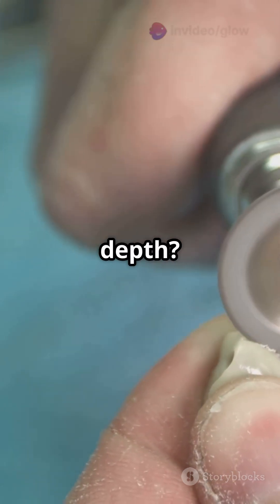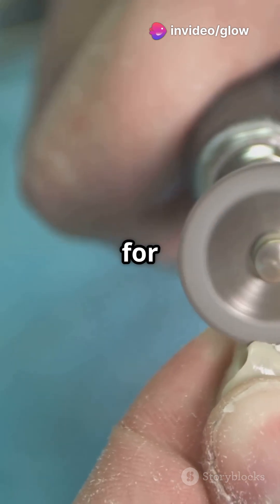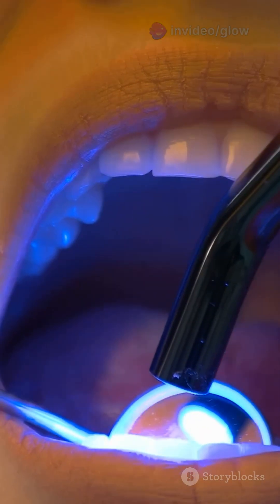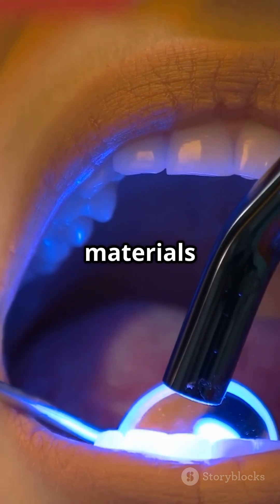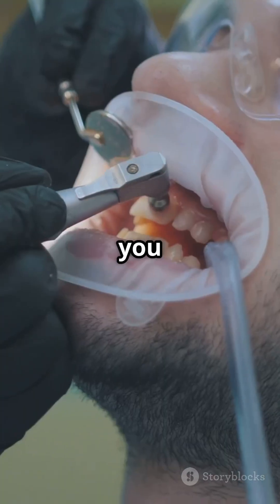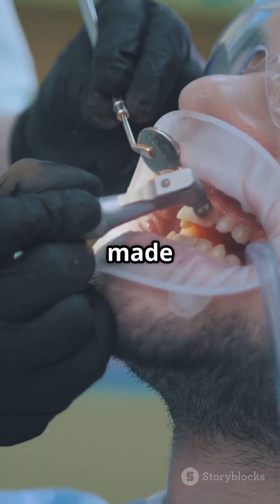And depth? Ideally 1.5 to 2 mm into the dentin for amalgam, but we go more conservative for composite restorations. Finally, our restorative materials: amalgam for more extension and composite resin for a conservative approach. There you have it — class 1 cavity prep made simple.